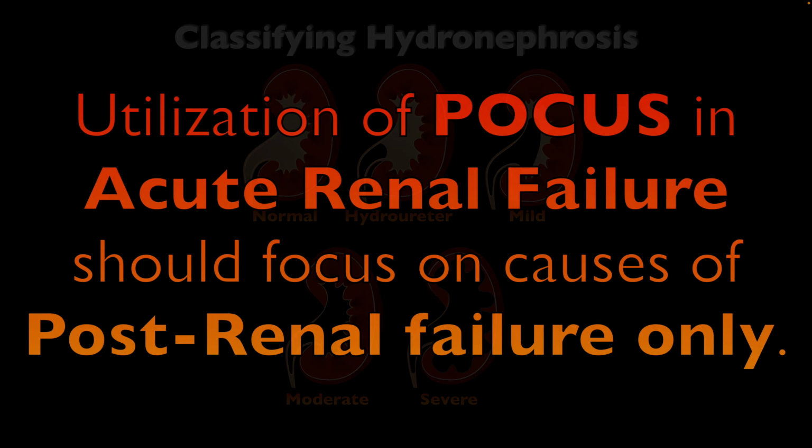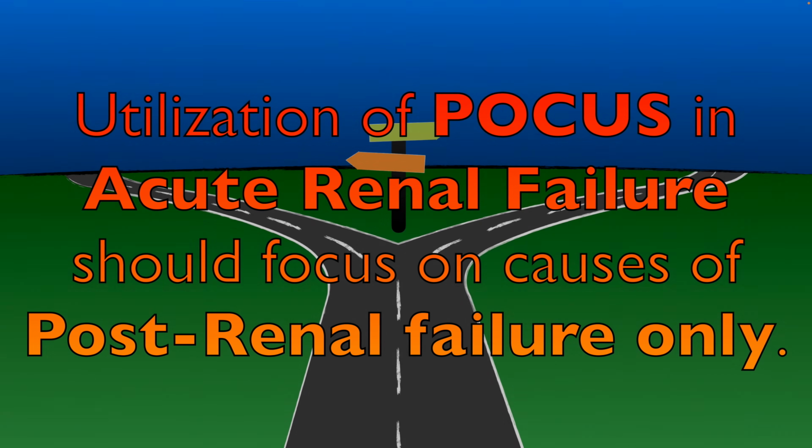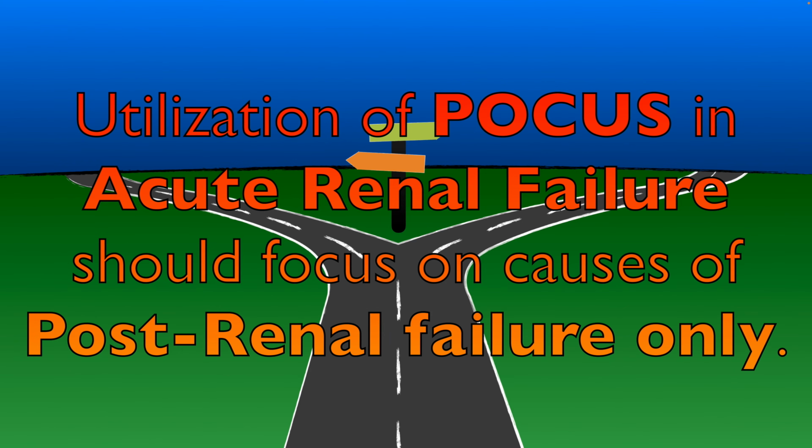So again, I'm just going to come back to this. Utilization of clinical ultrasound or point-of-care ultrasound in acute renal failure should focus on the causes of post-renal failure. So what we're going to look at is those kidneys and determine if they are developing hydronephrosis or not. If there is hydronephrosis, that may require further studies, whether that be a CAT scan, CT scan, or evaluation by our surgical colleagues. That is something to consider.